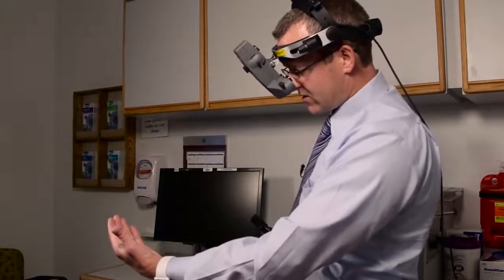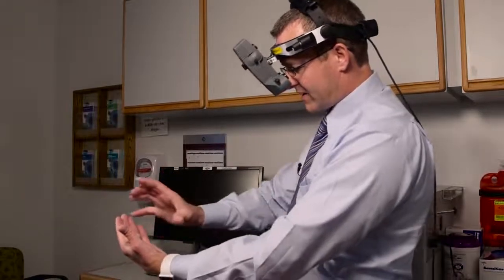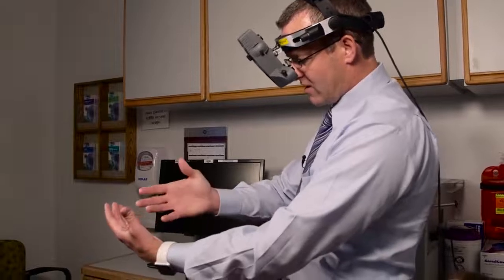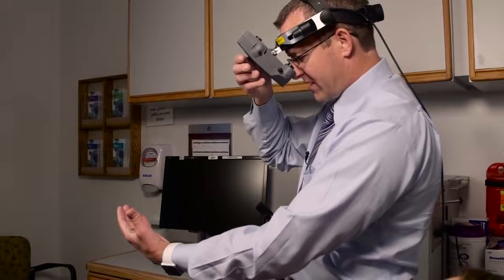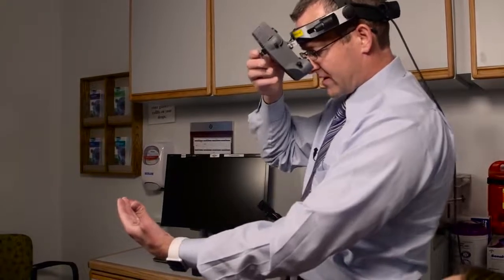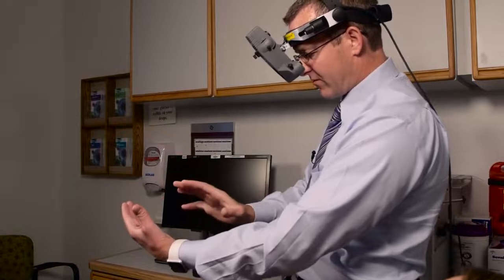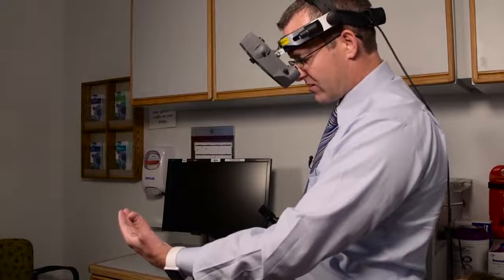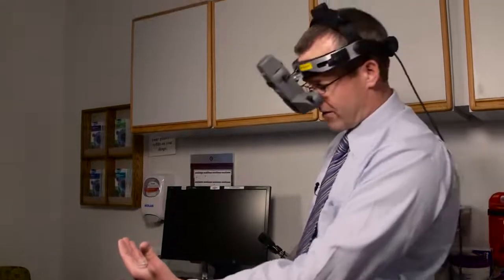Okay? Sometimes in starting out, obviously with more of a beam you get more light into the eye. Sometimes it makes the focusing in and out, the field of view a little bit better. You may want to start out using the wide beam and then shift over to the medium beam as you do your exam. But again, I generally use the medium-sized beam for most of my periphery exam except when I'm doing a scleral depressed exam, and then I use the wide beam. But you'll just have to play with it and decide what each of you like to do best.